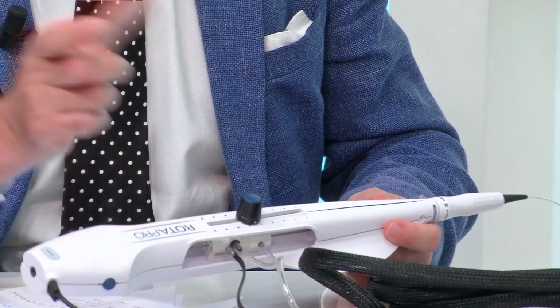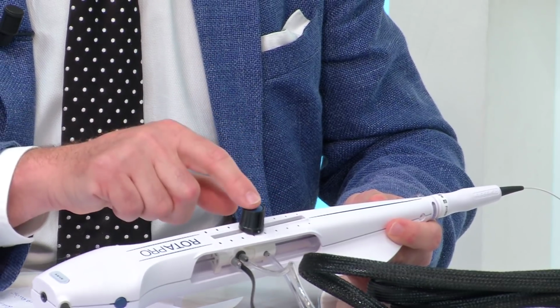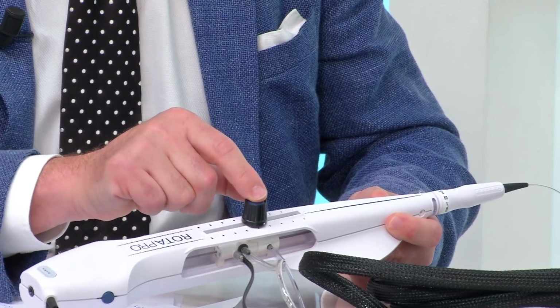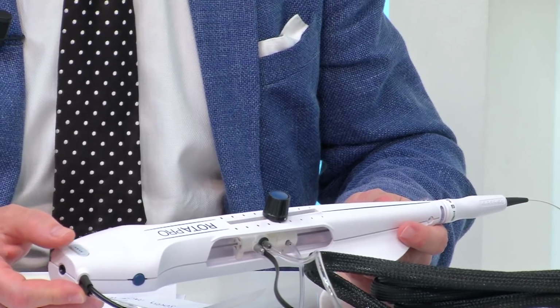So simple on and off. Then you press it again to turn it off. Yes, that's correct. You just repress and it stops. So you don't need to push on the pedal anymore. You just press on the button, do your pecking motion, your short run, then you repress on the button and it stops.